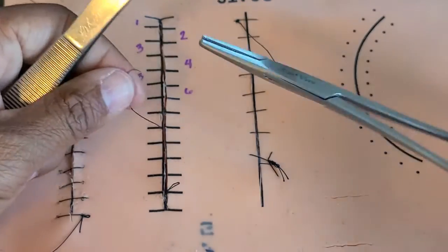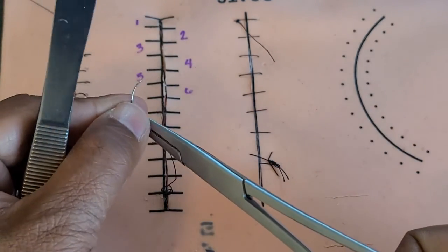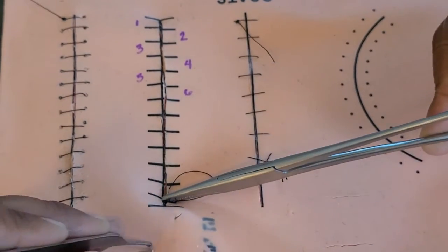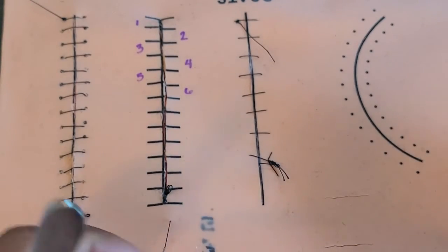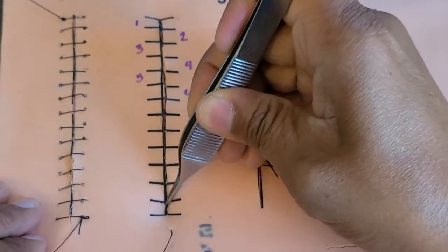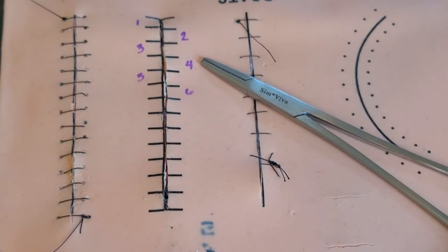If your loop is small enough, some people will also put the suture through, and then your final thing to do is go directly into the incision, out past the incisional line, and theoretically this should bury into the wound. If not, a lot of the time you can bury it. From there, you would cut your excess.